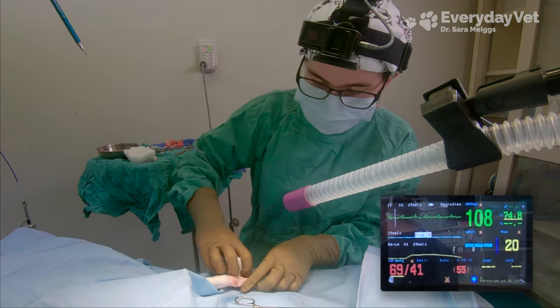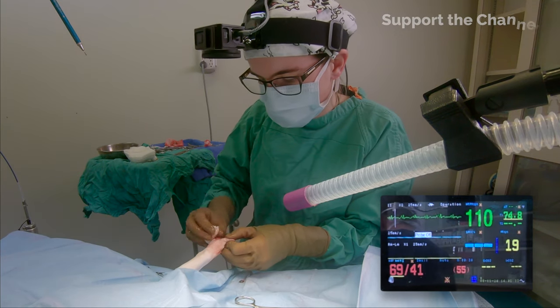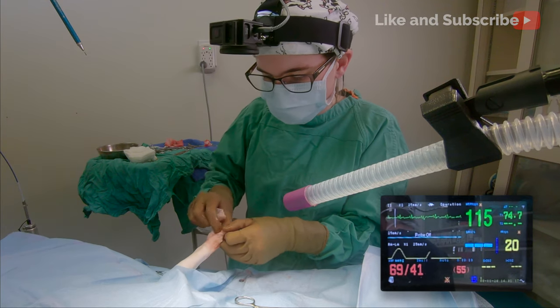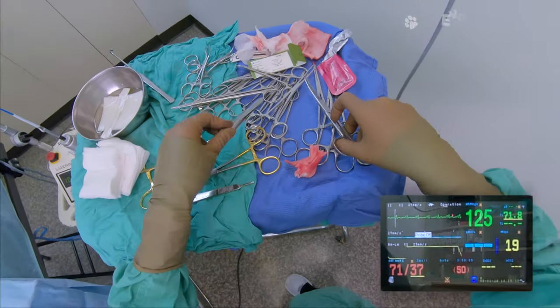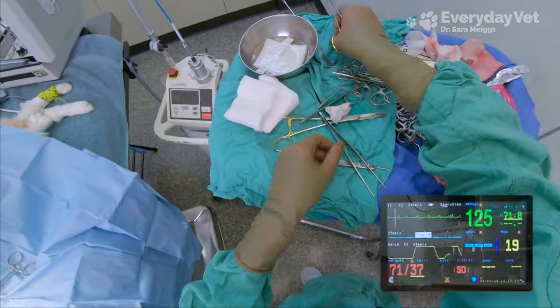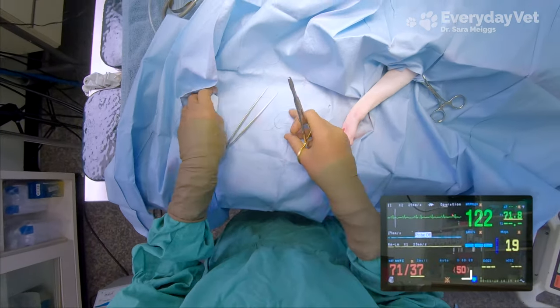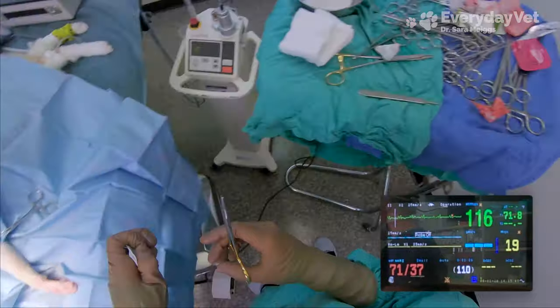Now that the toe is completely amputated, there's not going to be as much stimulation in that area, so I'm going to have my assistant start to lower the anesthesia so we can gradually start waking him up. I don't want to do it too fast because I don't want him to wake up while I'm suturing, but there's not going to be all of that sensation since we're not making the cuts anymore. Since that blood pressure is pretty low, it'll be a good idea to lower the gas and see if we can get that blood pressure a bit better.